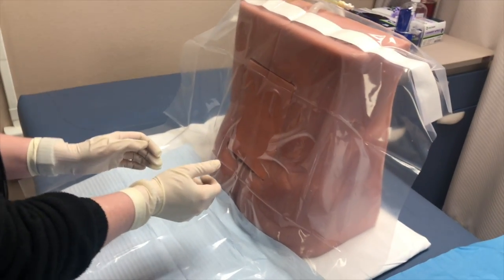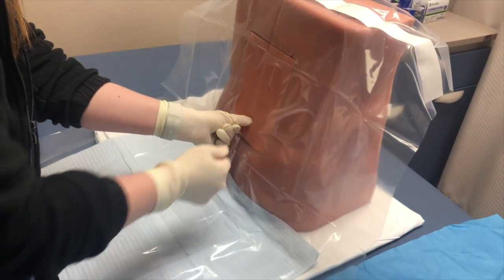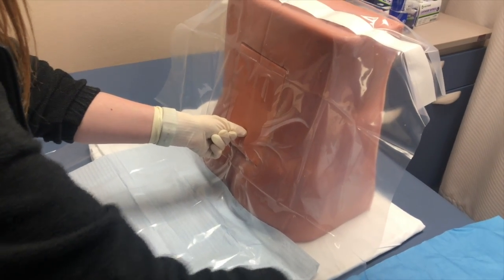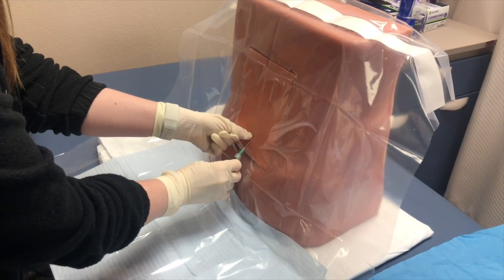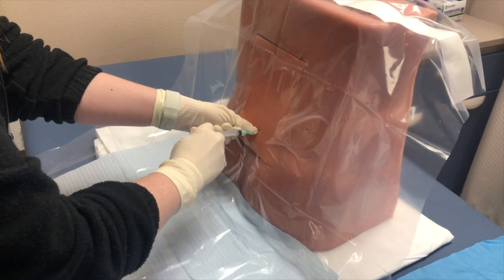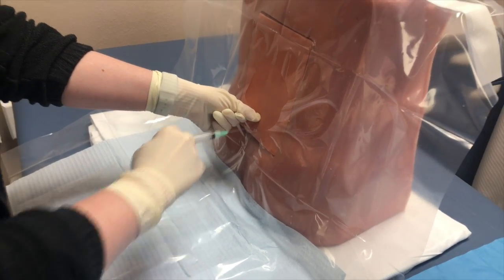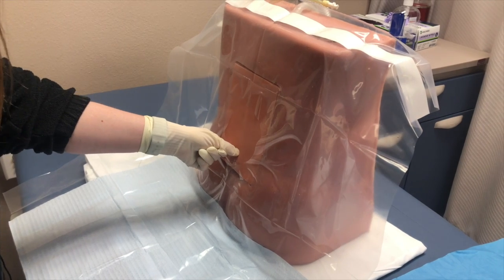Re-identify your anatomy. At this point, a rapid-acting local anesthetic such as 1% lidocaine is used for local infiltration of the area just adjacent to the identified spinous processes. Raise the skin wheal to place local anesthetic into the subdermal tissue most likely to contain nociceptors. Deep tissues, including the supraspinous ligament, can be anesthetized by spreading 3 to 5 milliliters of local anesthetic through the tissues in a fan-like pattern.